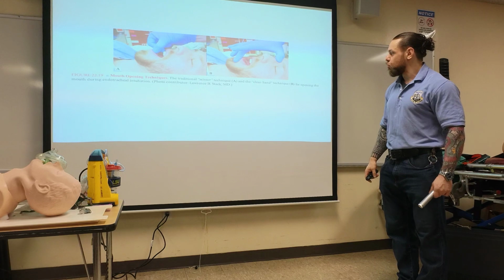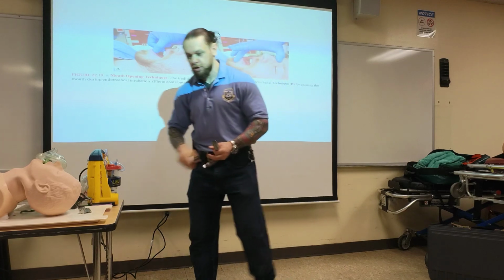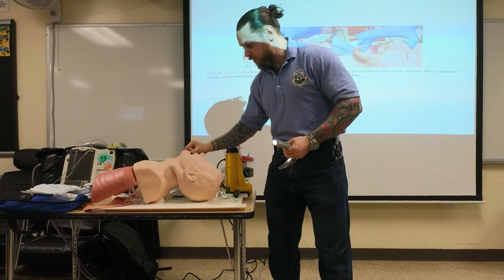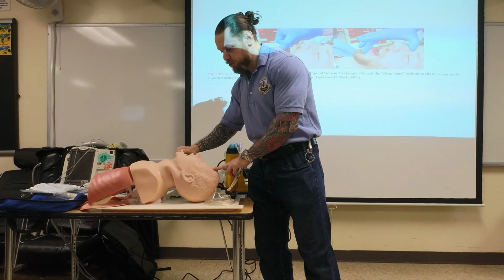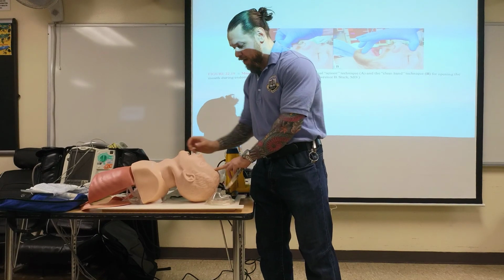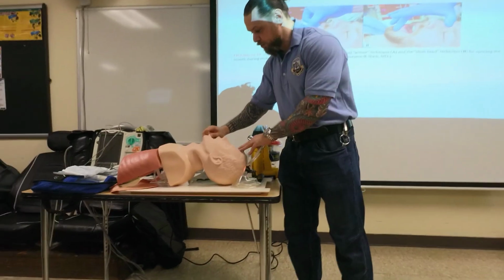They show you two techniques to open the mouth. I wouldn't recommend this technique because I don't want anyone to bite my fingers. I don't know their level, so when I'm inserting the OP, the technique I like is to find their lip and move their mouth down like that. You see where my hand is? I'm not on the teeth. So if they start to chomp down, my hand is not anywhere near the teeth. The technique they say is good, you may try, but I don't think it's going to be super effective for you. But this technique that I used was effective.